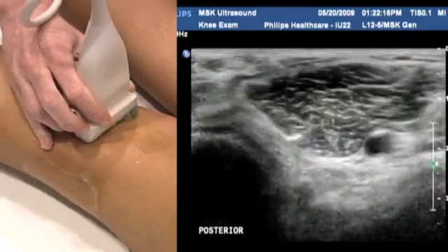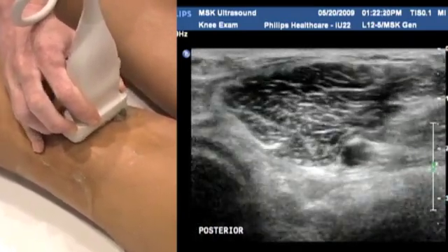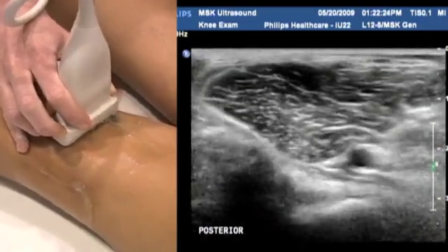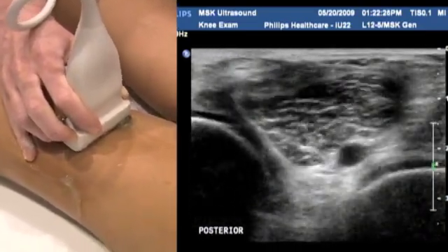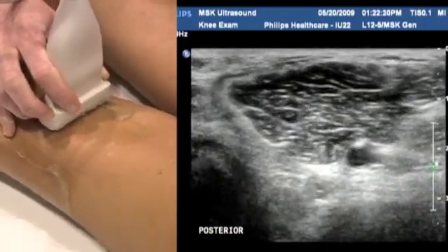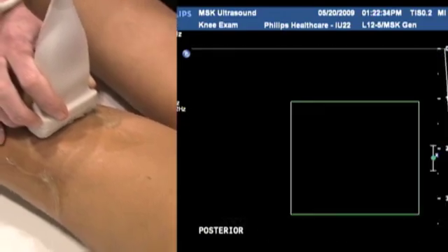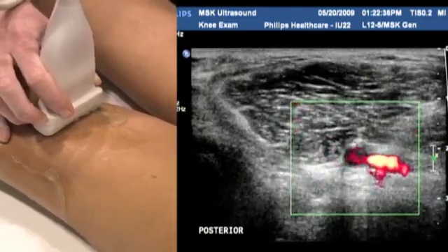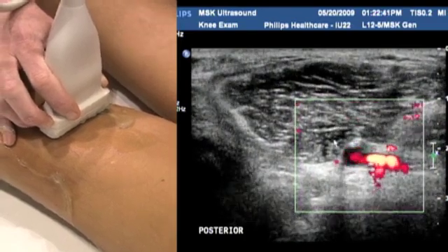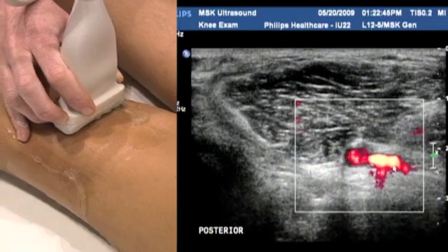Again, tibia, fibula, the deep structures that you see. You can see the popliteal artery pulsing away. Again, just as a sort of corollary to your study, it's a good idea just to scan through that small portion of the popliteal artery. Again, you can assess using colour Doppler, power Doppler also, if that's something that you prefer. You can see the artery pulsing and the vein next door.